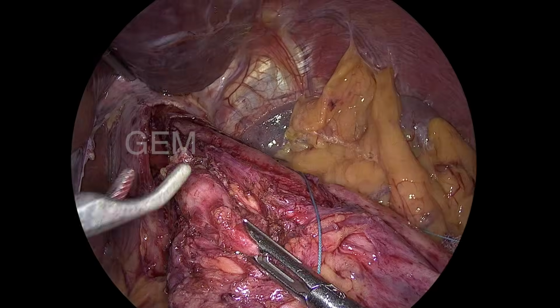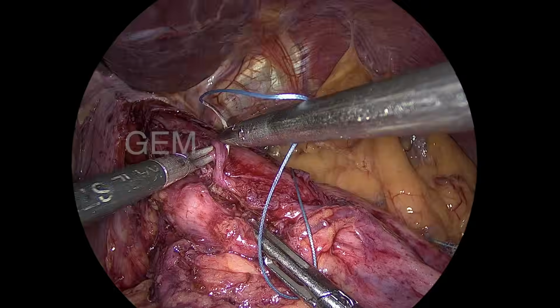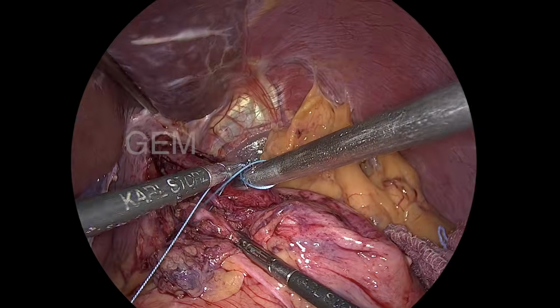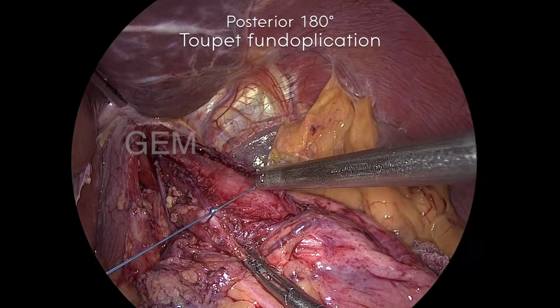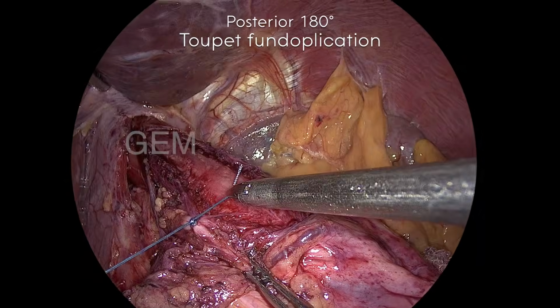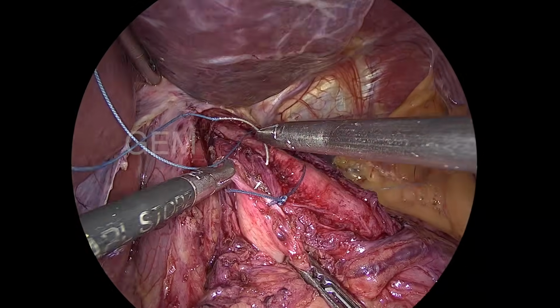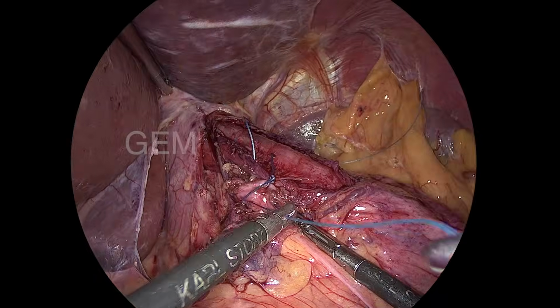So, now it is good, and I am going to take stitches, usually 3 stitches on the right side, from the divided end of the esophageal muscle to the posterior wall of the fundus. That is 3 stitches, and then 3 stitches on the other side. So, totally 6 stitches, and the posterior Toupet fundoplication is done. Reflux control is better with the posterior Toupet fundoplication. Again, posterior wall of fundus to the divided edge of esophageal muscle on the right side.